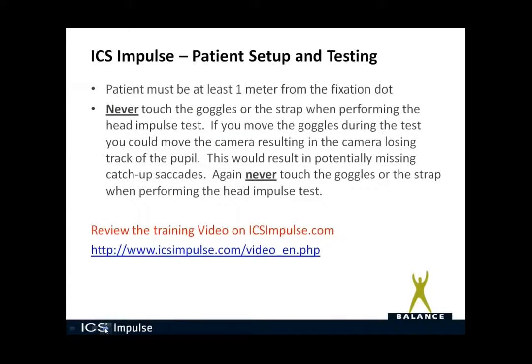Now let's talk about patient setup and testing. The patient must be at least 1 meter from the fixation dot. Why is that?